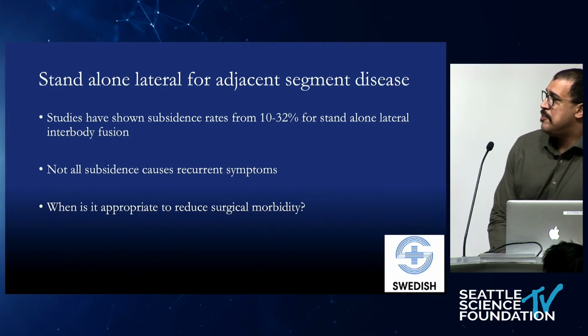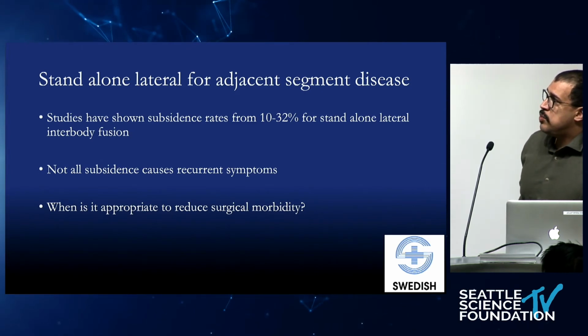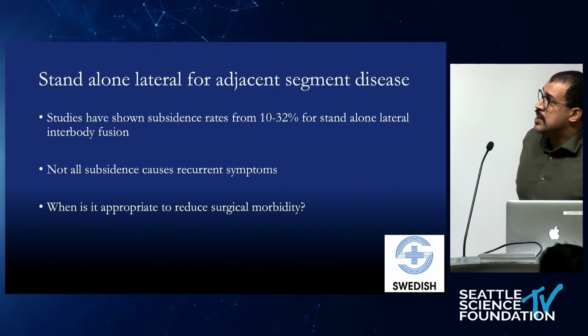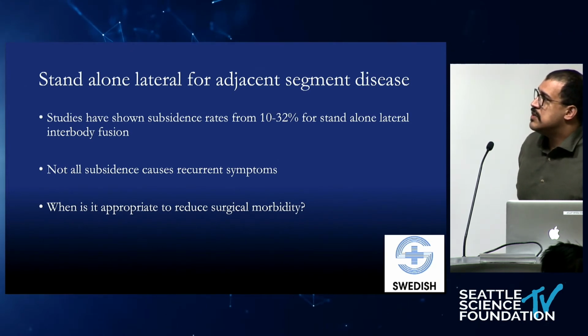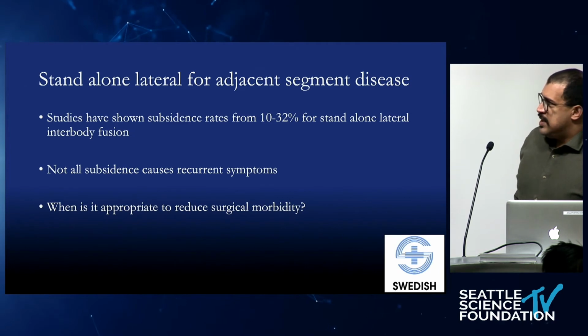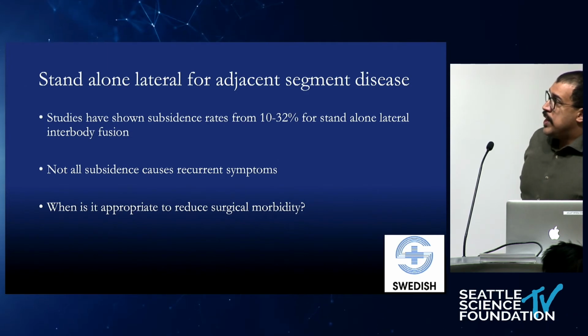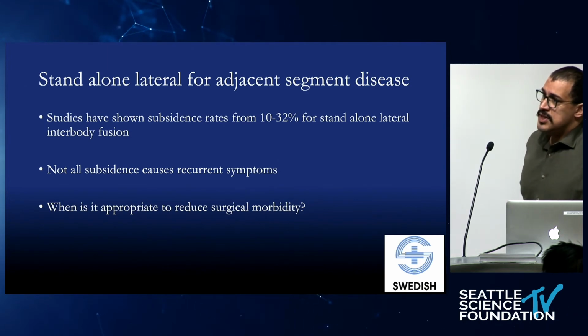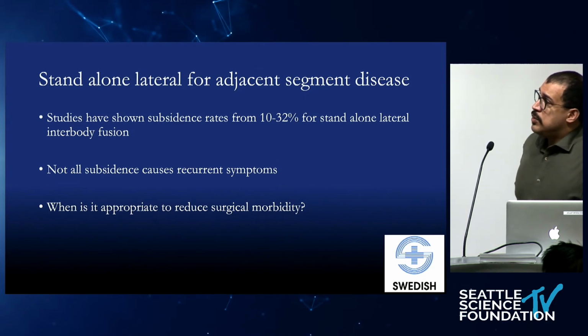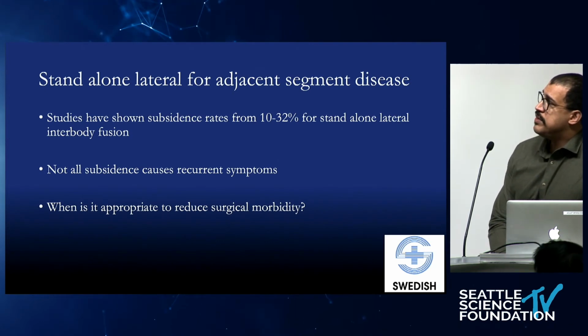And standalone lateral, we're looking at being less invasive. If you have a previous fusion, that's one of the least invasive techniques that we can do. They're kind of all across the board in terms of what the subsidence rate is. I've seen up to 32%, so that's something that we'd wonder whether it's the surgeon technique, or the kind of implant you're using, but again, there has been a reported very high rate of subsidence, and you're not going to get that foraminal decompression or the central decompression if you do lose the reduction that you were getting or that elevation of the end plates.